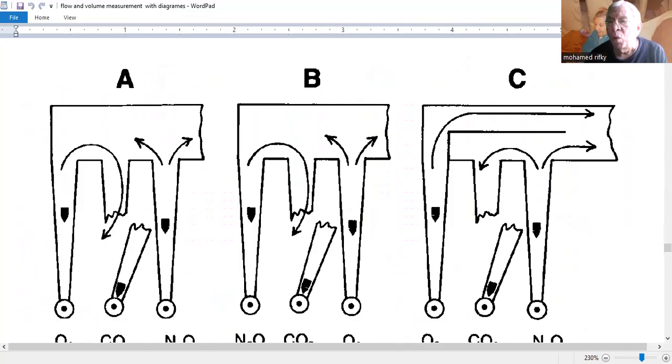And this is how we deal with the case of breaking down of the flow meter, which may develop a hypoxic mixture of oxygen and nitrous oxide.